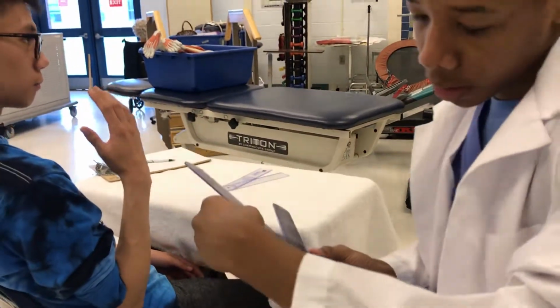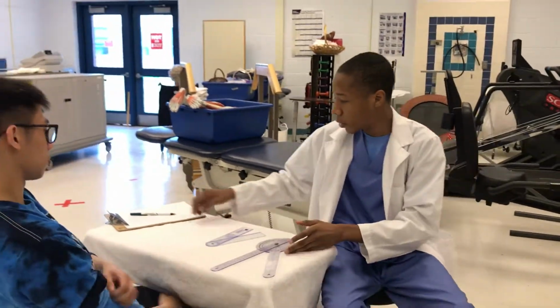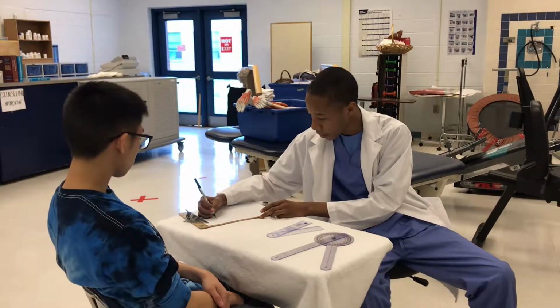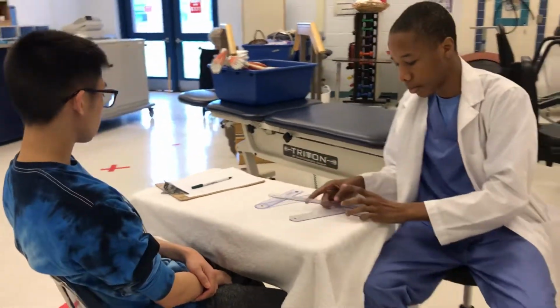So the patient had 140 degrees of elbow flexion, and the normal is about 150, so our patient is a little bit under normal. And then I would record the data on the clipboard.